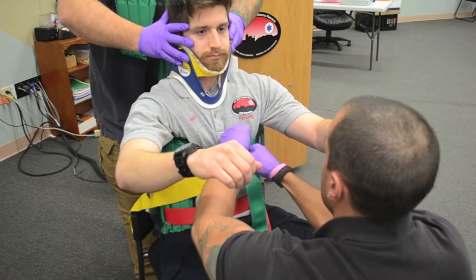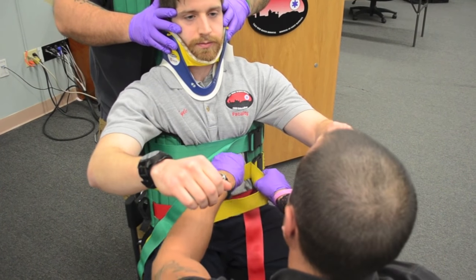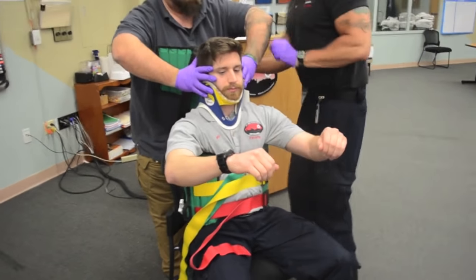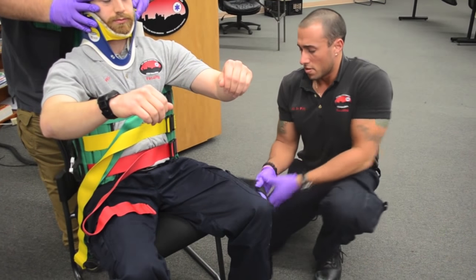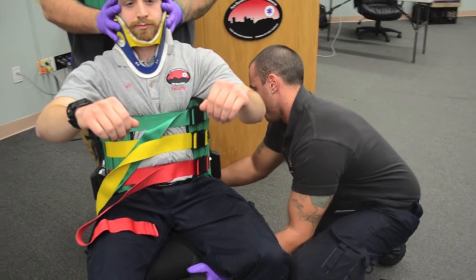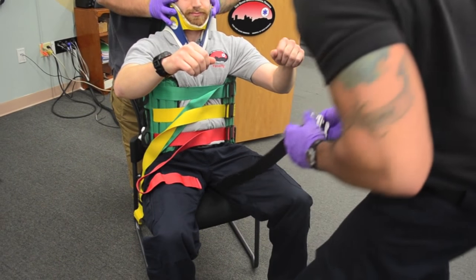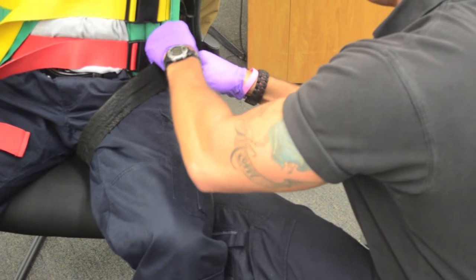Take a deep breath in — let it out. Deep breath in — let it out. Deep breath in — let it out. I am going to advise the patient that it is going to get a little bit uncomfortable. Make sure to shimmy the strap so it is in the proper place. Moving to the front, pulling all of the excess and feeding the strap until it is secure.